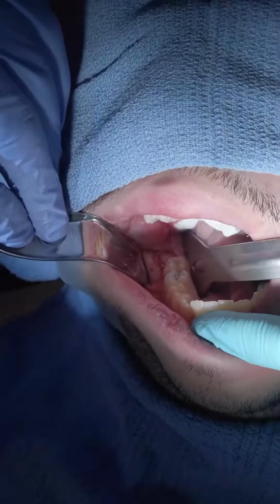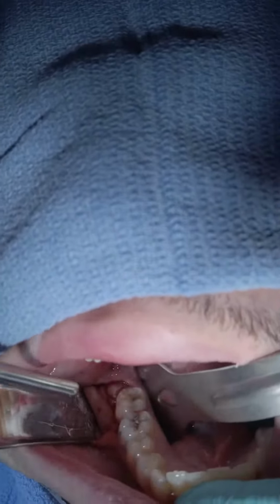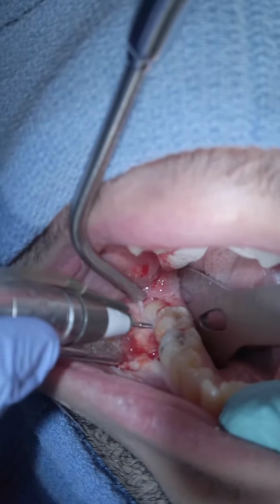Okay. So the next thing we've got to do is a little bone removal right here. What we're going to do is expose this entire crown because we've got to know what we're dealing with and where we need to split this thing out.